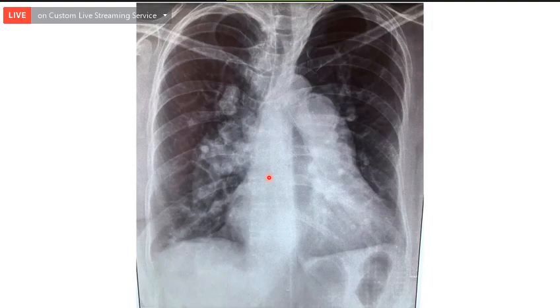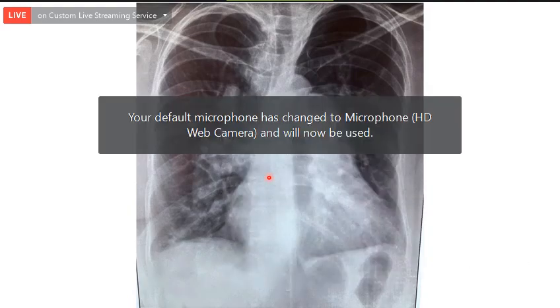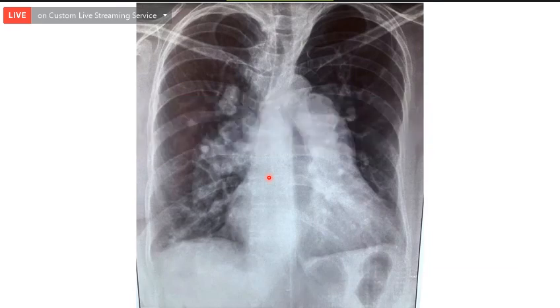And also there is evidence of left to right shunt. So, yes, sir, this must be the PDA, possibly. A shunt lesion which has subsequently developed into pulmonary arterial hypertension and Eisenmenger reaction. Whenever you see, in a 64-year-old female, such a large number of end-on vessels with the prominent pulmonary artery segment and all, what should be your possible diagnosis?